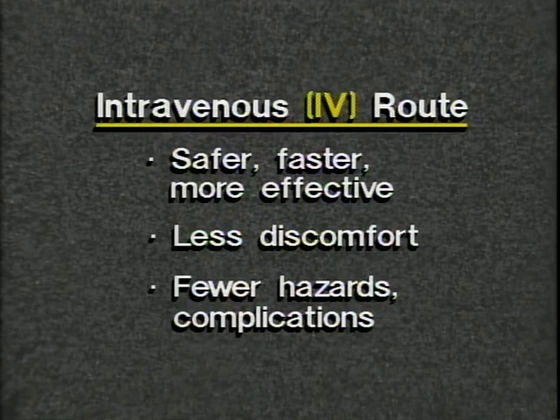Infusion therapy means less discomfort and fewer hazards and complications. Sterile needles are used only for the patient, so there is no risk to the patient of catching AIDS or hepatitis from the IV needles.